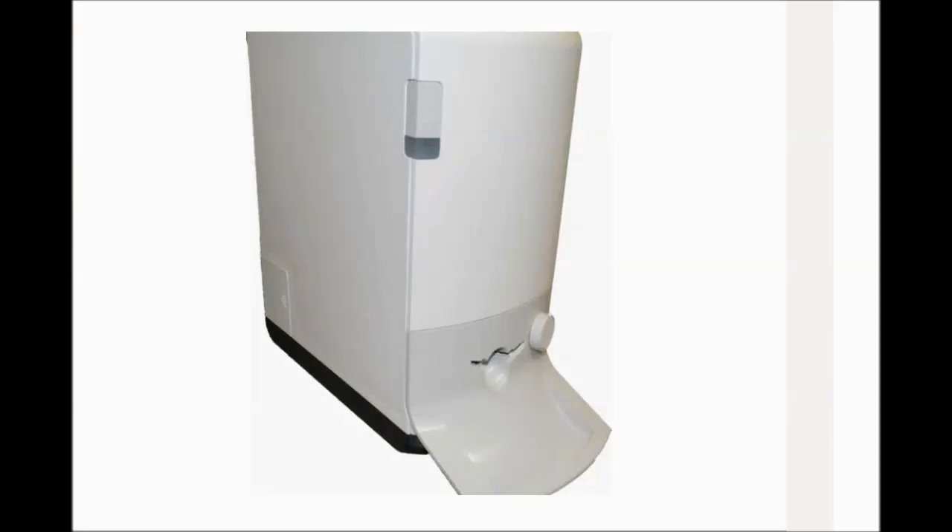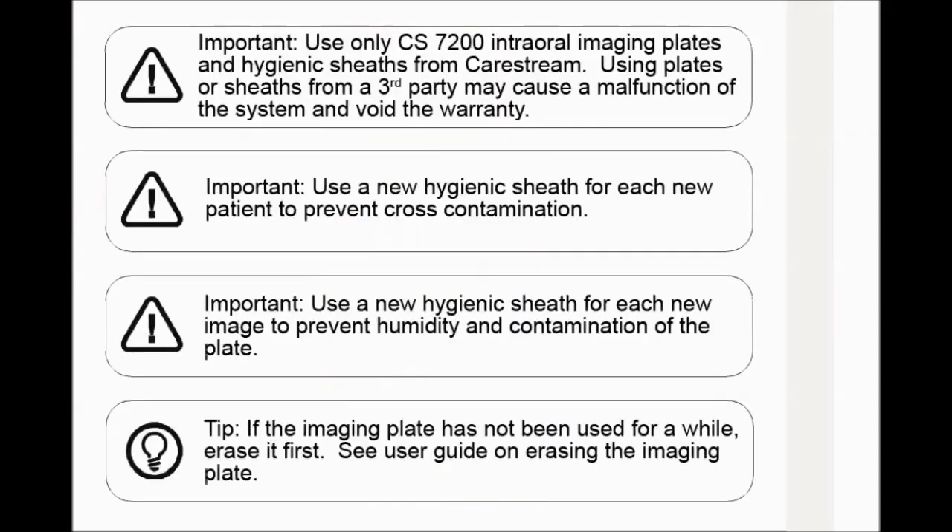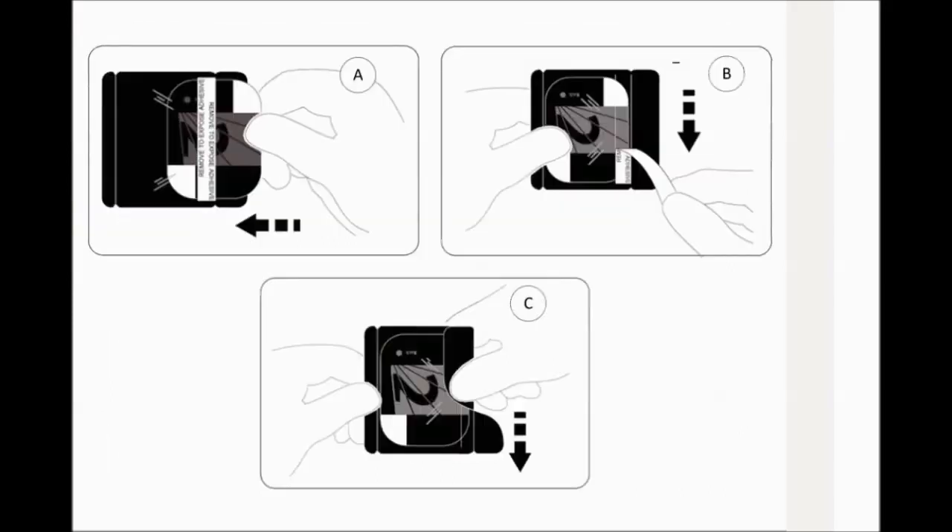Preparing the Imaging Plates. To prepare the intraoral imaging plate, choose an imaging plate of the appropriate size for your examination. Insert the imaging plate into its protective hygienic sheath with the inactive side facing the adhesive strip. The imaging plate size number can be seen through the transparent side of the hygienic sheath, and the orientation mark is visible in the bottom corner. Peel the adhesive strip's protective paper to seal the hygienic sheath. Handle the imaging plate by holding the hygienic sheath's empty edge where the silicone strip is.